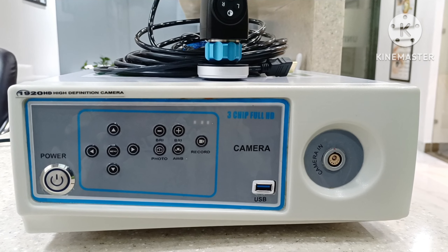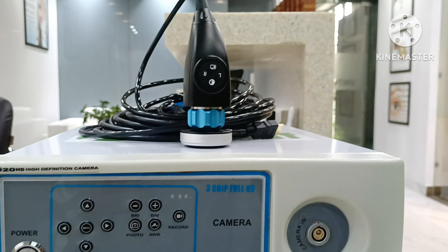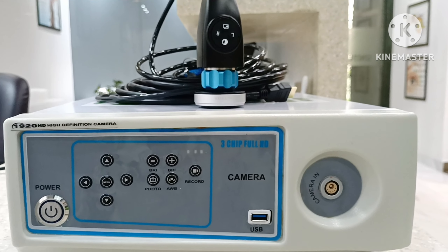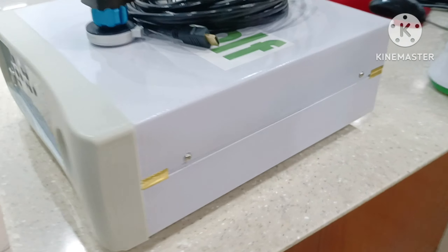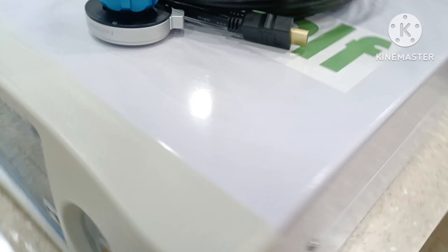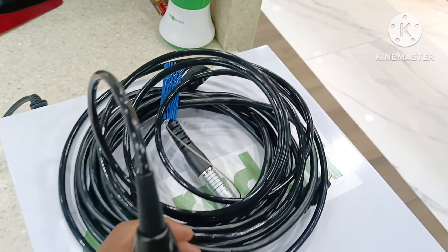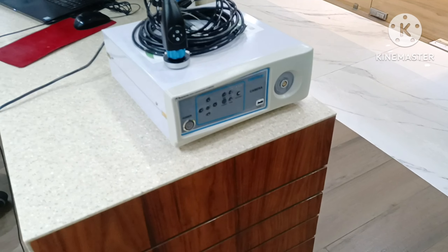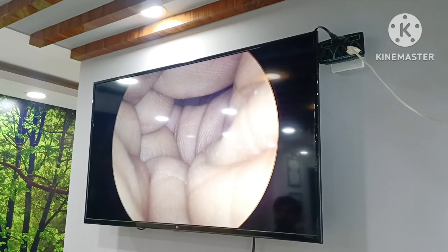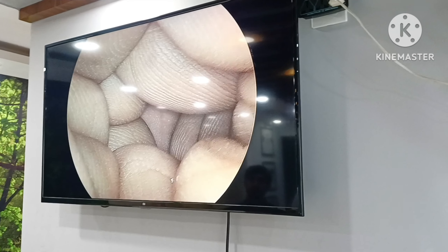Endoscopy camera, high definition 1920 HD, 3-chip full HD. You can use it in all specialties like ENT, laparoscopy, cystoscopy, urology, and gynecology. All-in-one camera, full HD endoscopy camera. CC clarity with good quality full HD.